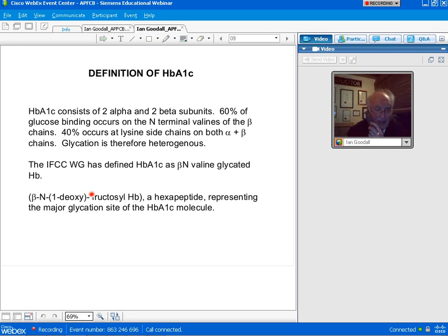And these are now certified by the Institute for Reference Materials and Measurements, and their numbers are 466 and 467. And they're really bought by the companies or by any kind of people who are running major exercises. But the cost of them, I'm not sure how much you get in a vial, but this is about 800 euros, and the non-glycated one's about 600 euros, so they're not cheap. So they're not the kind of things that are ever bought by a laboratory.